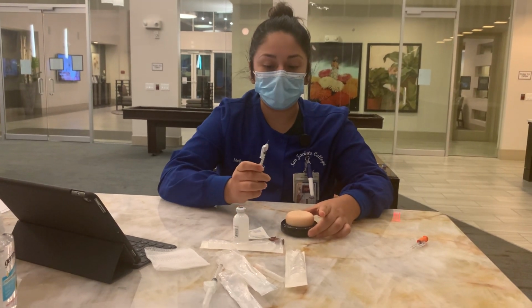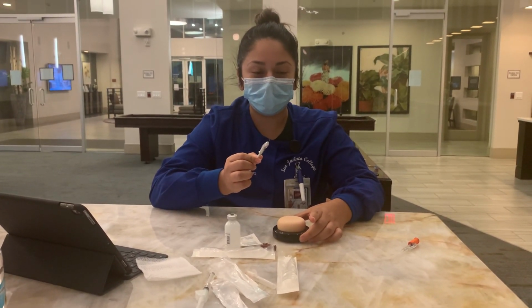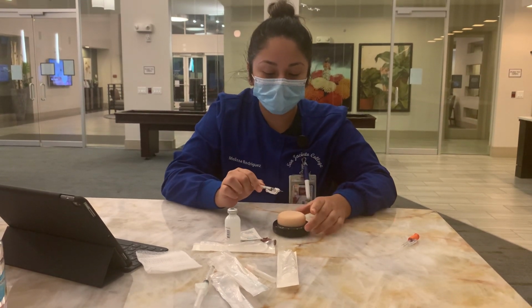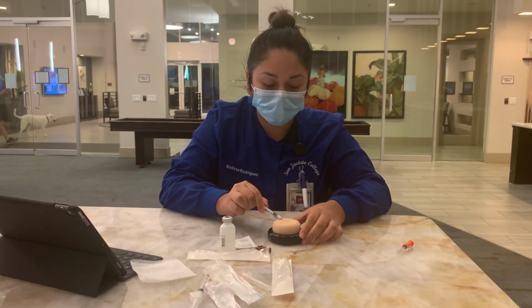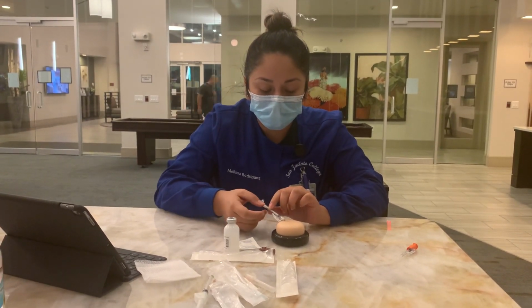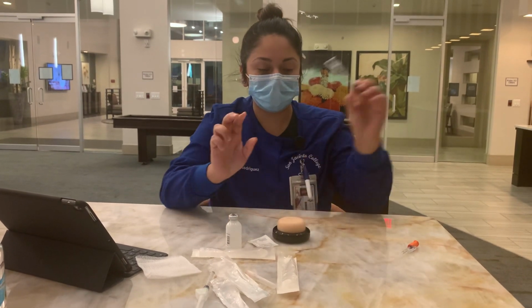I'm gonna go in at a 15 degree angle with my, I don't know what it's called right now, bevel up at 15 degrees. Once I insert into the site, I insert my medication, maybe a small bleb. Remove the needle and recap it and dispose of it in the sharps container.